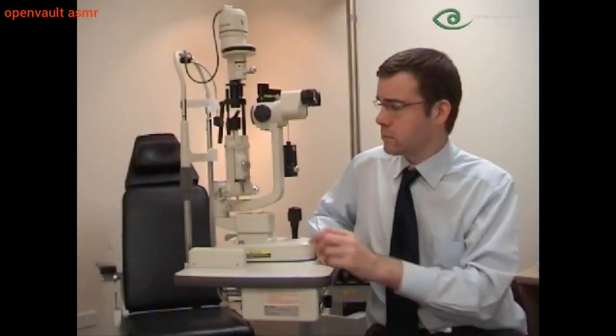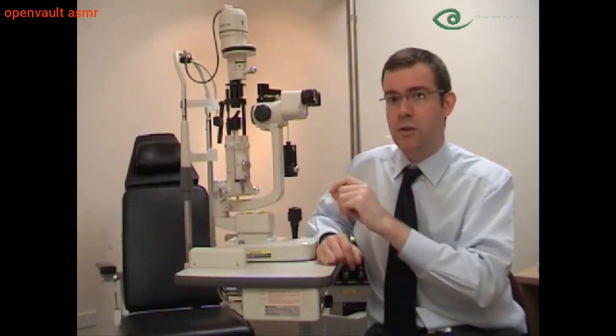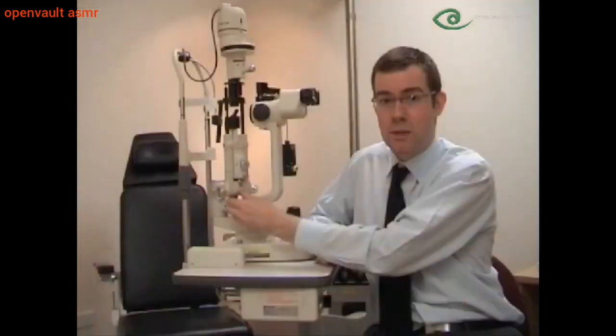There are another couple of knobs to be aware of. Normally we want the slit of light and our microscope to be focused at the same point, and we call it coupled. And to achieve that, this knob should be tightened. We can also adjust the inclination of light by releasing this lever, but for most purposes the lever should be in the locked position.